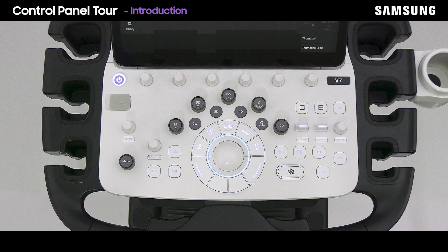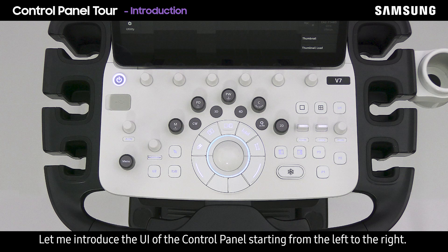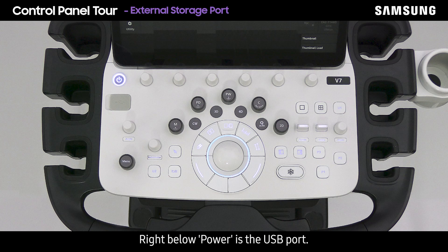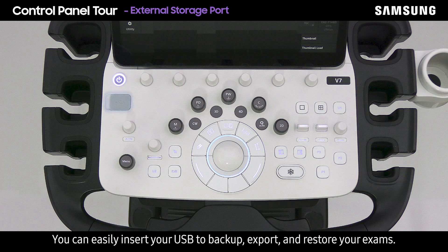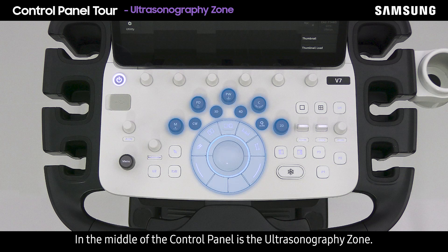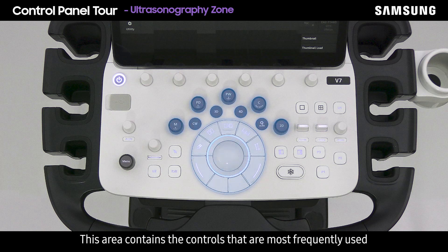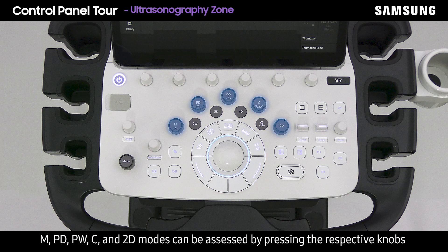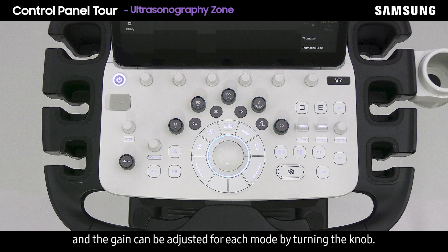The functions of the control panel are constructed and arranged very intuitively. Starting from the left to the right: the power button, used to turn on and off the system, is located on the upper left corner. Right below power is the USB port — you can easily insert your USB to back up, export, and restore your exams. Images can be saved to the USB during an exam by pressing the P key. In the middle is the ultrasonography zone, containing the most frequently used controls during an ultrasound examination.